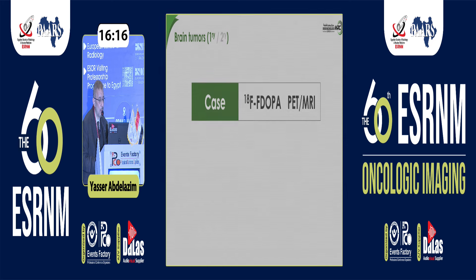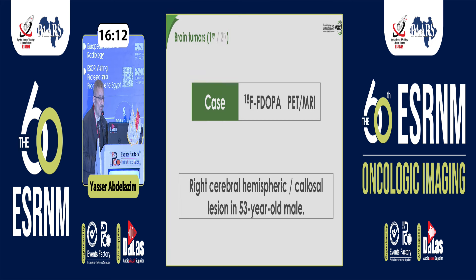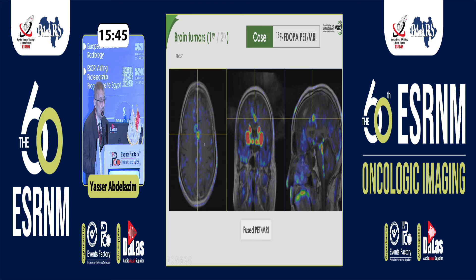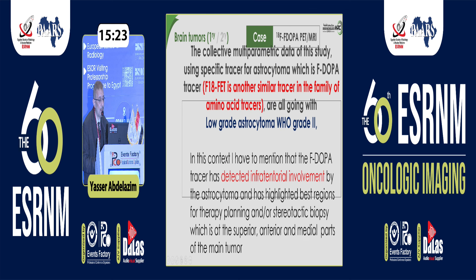Another case: low-grade astrocytoma, and fortunately this patient could afford F-DOPA, which is much more expensive than FDG. Here we have a low-grade astrocytoma by all scanning techniques — FLAIR, diffusion, T2 shine-through effect, very faint enhancement. When you use F-DOPA, look at how there is high uptake in the parts with low-grade tumor, because amino acid tracers are so sensitive to gliomas even if they are low-grade. We can also see multifocal spread inferiorly, and we highlighted the parts of more aggressiveness to guide biopsy.